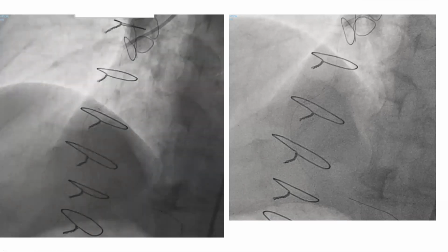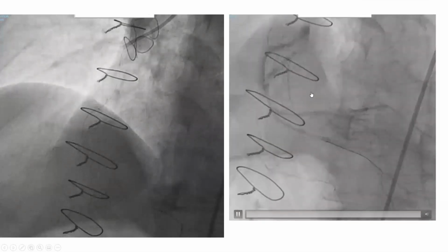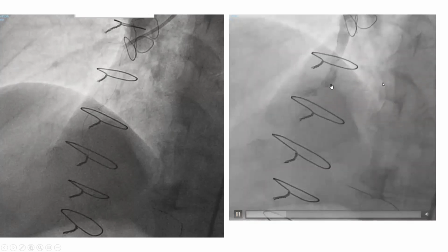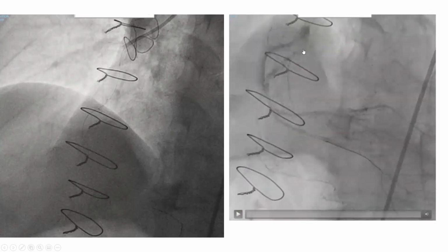After that, distal Integrilin and Nipride were administered through a dual lumen catheter. Then it was decided to stent focally that area without placing another filter wire. You could consider placing another filter wire, but like I said, to limit manipulations, you may just go straight with a stent at this point, and this is what was done here. And the key here to limit further embolization is to do very focal short stenting. It was a 3 by 16 millimeter stent, slightly undersized, a short, focal spot stent to limit further embolization.